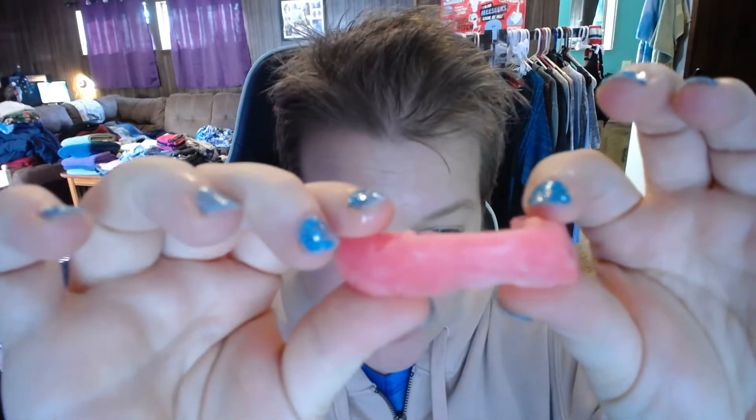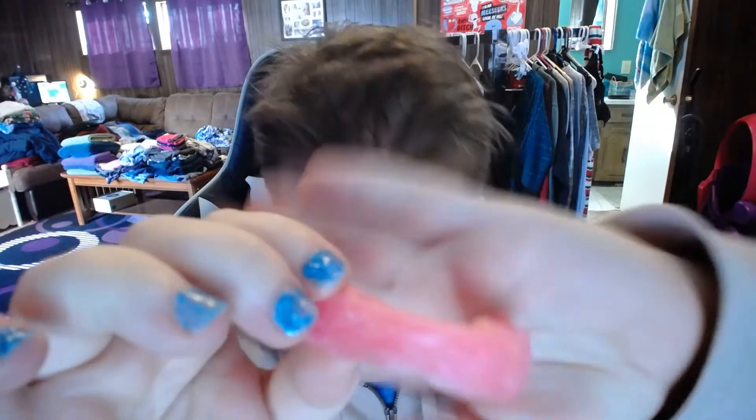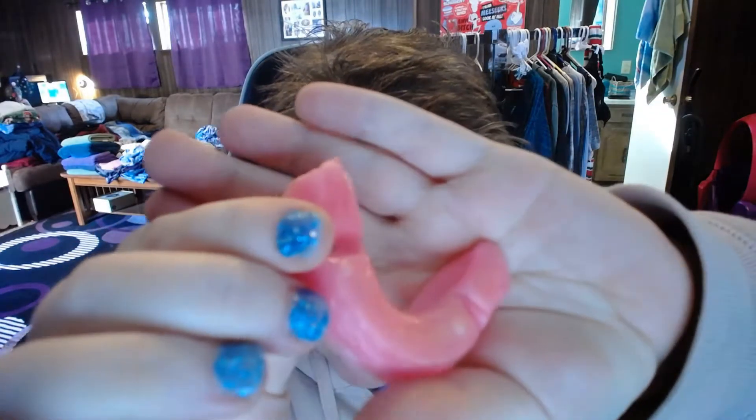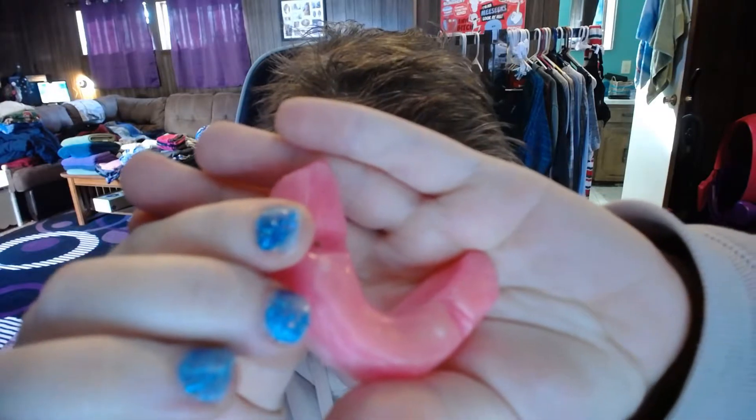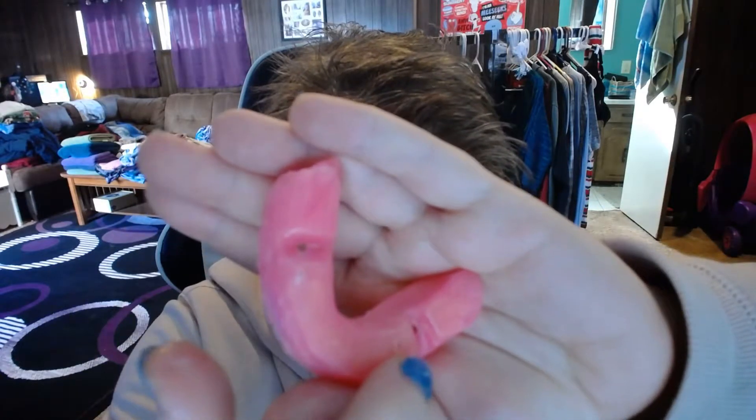I don't have extra wax to build it up, but this one is a little bit short. If you look, you can see where my implants come up through. There are indent marks where my implants come up through, and that's okay.